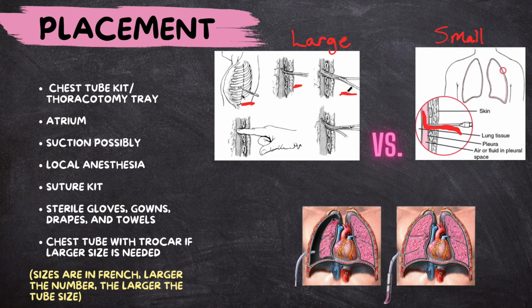Then you can see in the last picture, they've got their finger in the hole. So that seems kind of barbaric, but you know, as far as feeling the right space and where you're at, that was one of the go-to ways to do it. And then, once they figure out placement, they either take the tube in with the forceps, or they can actually feed it in with their finger still in there and make sure that they feel like it's in the right place.